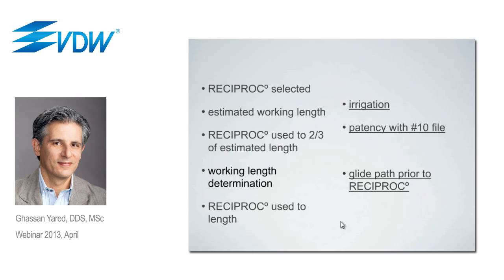And this is why, again, I said that this step of the working length determination is very important. Actually, this step is not special only for single file reciprocation, but this is also what we have to do if we were to use the rotary instruments in a safe manner.